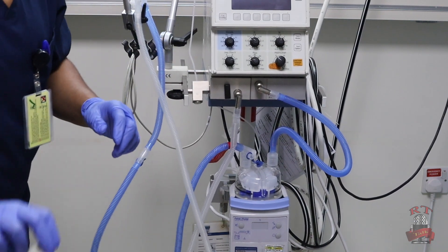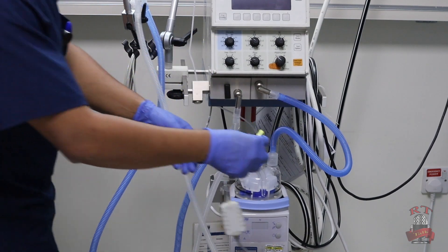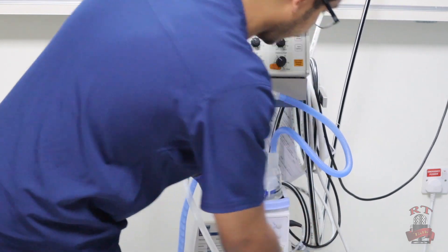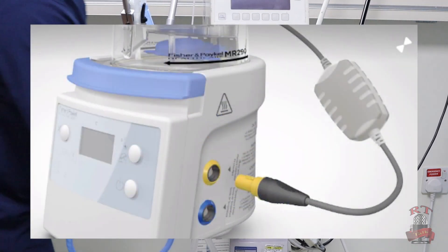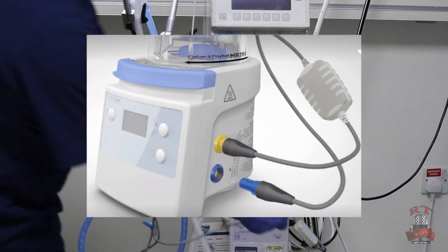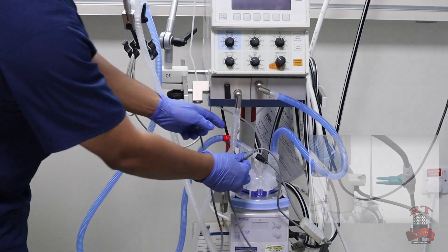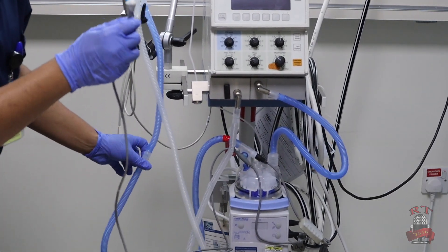We have two cables. The yellow one is for the heated wire — I will connect it on the side of the humidifier, as you see in the picture. Then I will take the other one, the blue one, and connect it in the inspiratory limb.